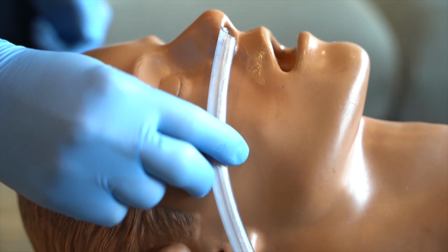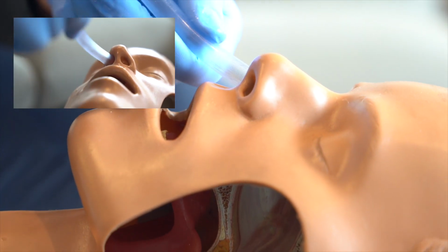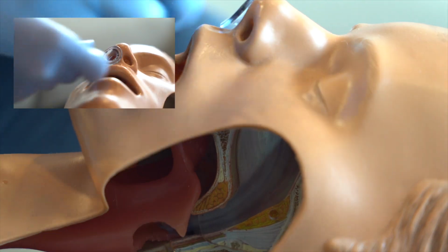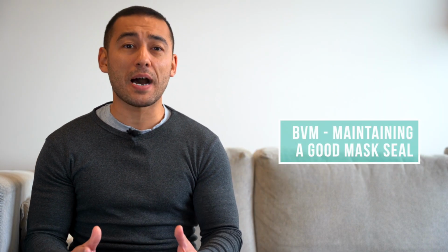A properly placed NPA also has the added benefit of preventing the soft palate from occluding the nasopharynx. To identify the correct size, measure from the corner of the nose to the earlobe. Lubricate the distal end and advance the NPA along the floor of the nasal cavity until the flange rests against the nostril. Once airway patency is maximized, attention should turn to maintaining a good mask seal.